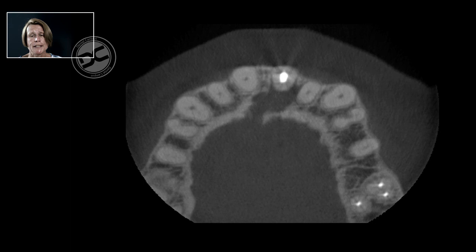Another area where the use of cone beam CT may be relevant may be the upper maxillary front, as in that area we are often challenged by the placement of an implant after a traumatic loss of a tooth. Now, in that area, we have normally the nasopalatine canal situated, which has a content with neurosensory fibers. Sometimes the canal is enlarged by trauma to the front.